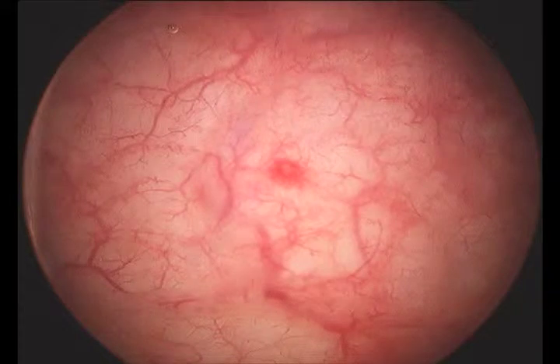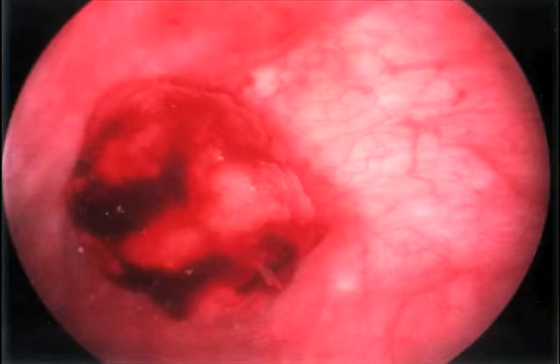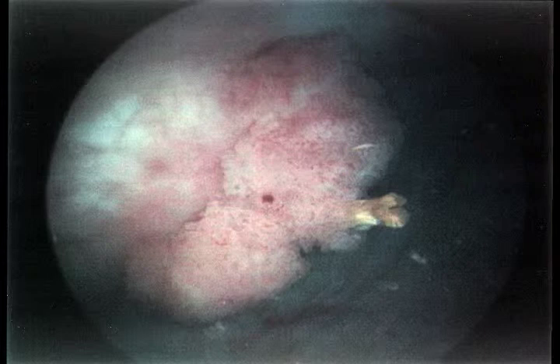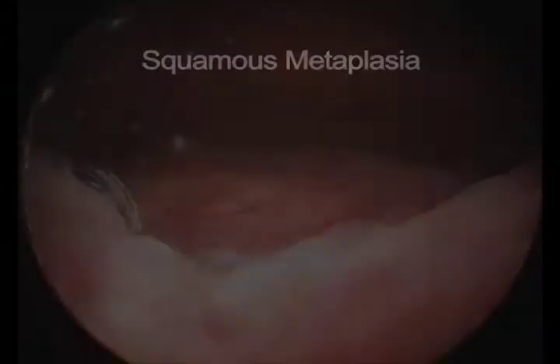In some pathological conditions such as interstitial cystitis, a gathering of capillaries may be demonstrated as shown here, which is referred to as a glomerulation. If one is not entirely certain that this is a glomerulation, it too should be biopsied as a precaution. A lesion growing from the wall of the bladder should be biopsied with the anticipation that this likely represents a carcinoma. A lesion such as this with a grape-like cluster of cells typically represents a transitional cell carcinoma. It too should be biopsied and treated.